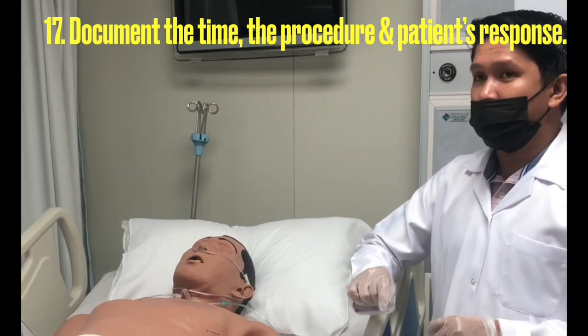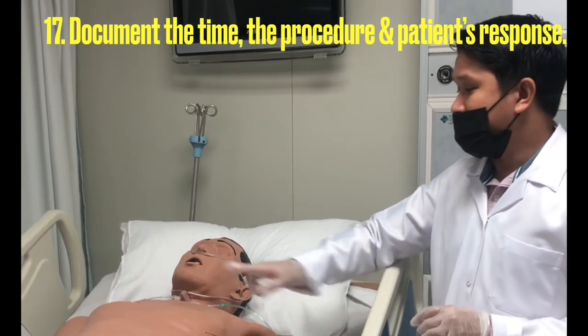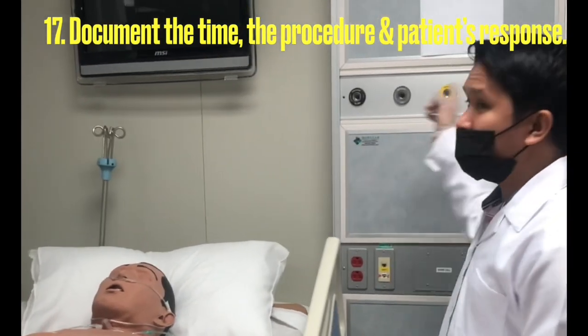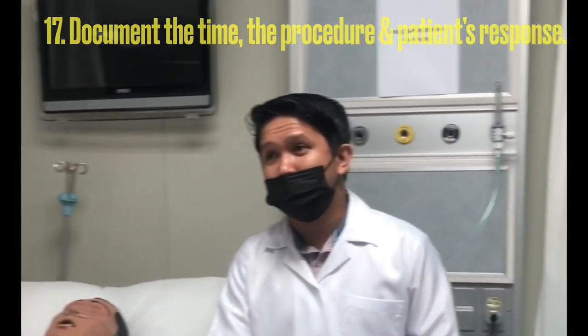Document the procedure as follows: 'Oxygen inhalation administered by nasal cannula, regulated at 3 liters per minute, as ordered by the doctor.'